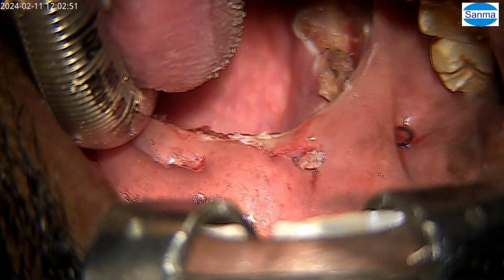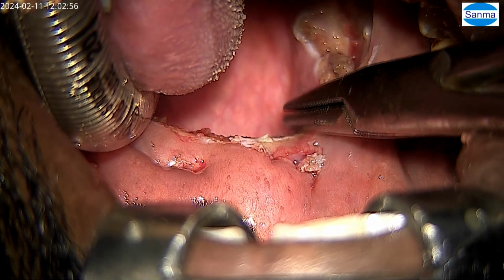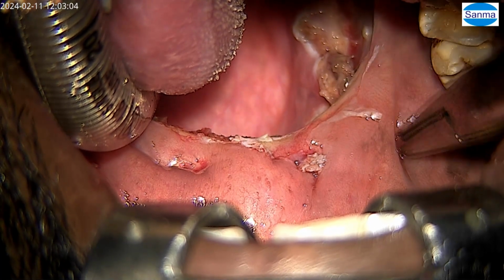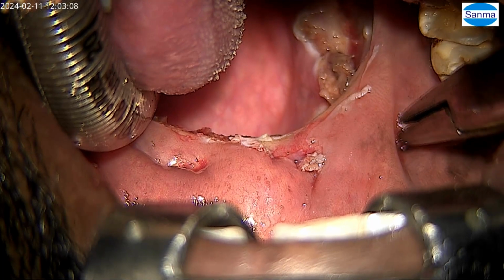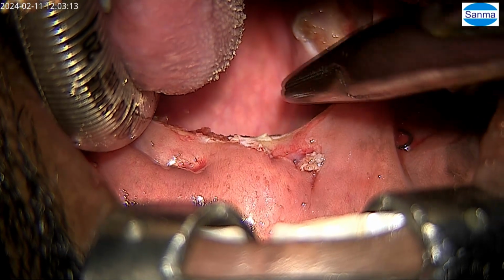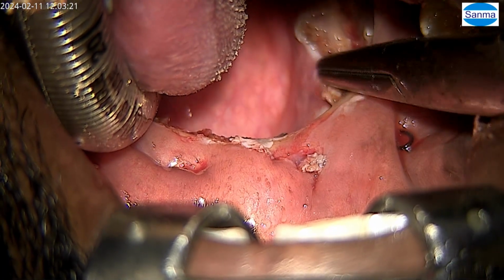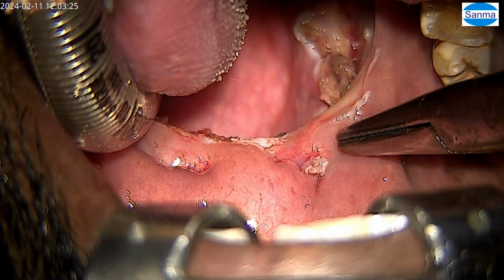The AP collapse was also contributed by this posterior pillar, which I have transposed laterally. The lateral collapse is pulled. The lateral collapse was because of this area, which is already pulled, because I have pulled the posterior pillar. So the whole complex is tethered to the pterygomandibular raphe. This raphe is anterior to the soft palate and lateral, and therefore now this is acting like a suspension bridge. Lateral is by absorbable suture, and anteroposterior by a non-absorbable suture.